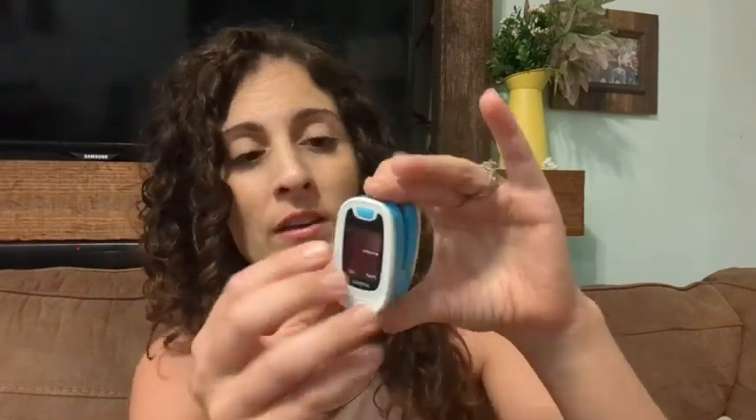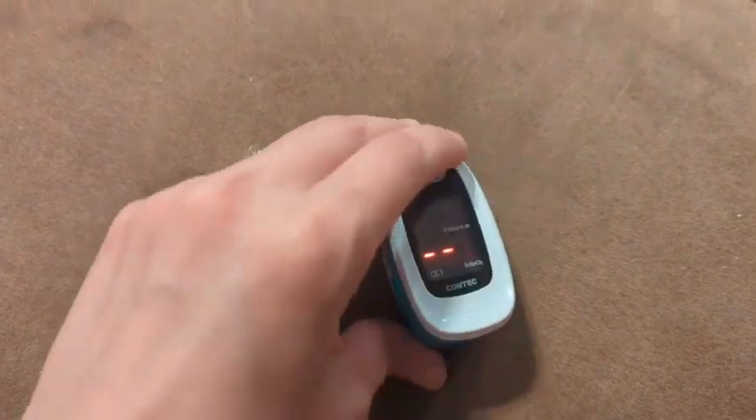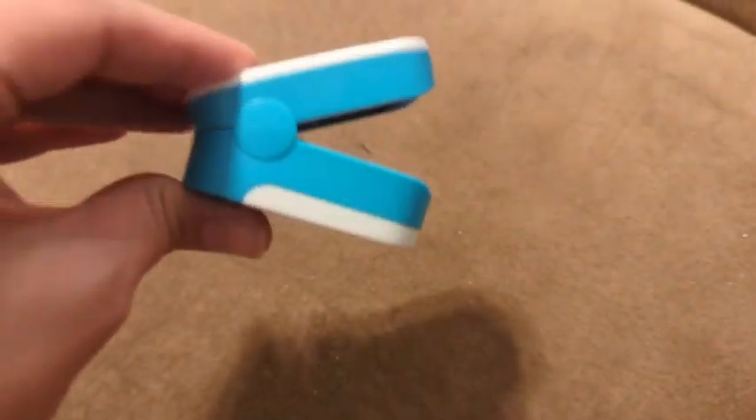Hey guys, this is Danielle with WTI, and I'm here to share with you this pulse oximeter. This is great for checking the oxygen levels on your breathing. I've been using this with my children — I'm going to show you what it looks like. Both of my kids are sick constantly and they have really bad coughs, and sometimes I get really worried that they're actually having a hard time breathing.